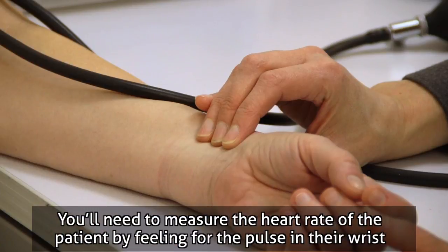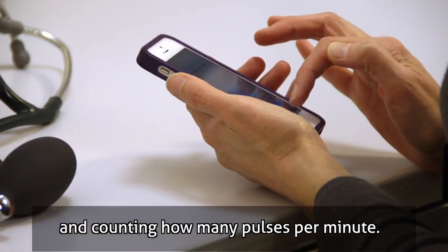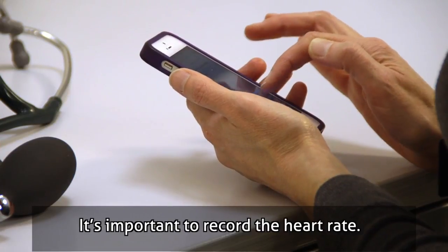You'll need to measure the heart rate of the patient by feeling for the pulse in their wrist and counting how many pulses per minute. It's important to record the heart rate.